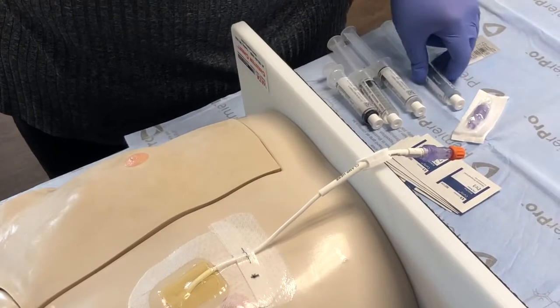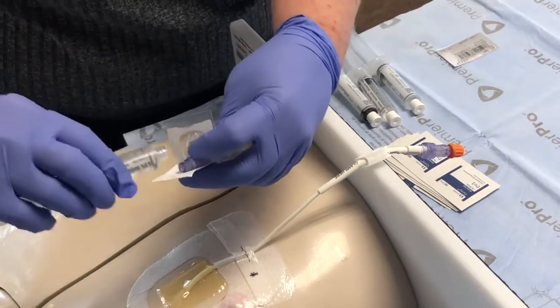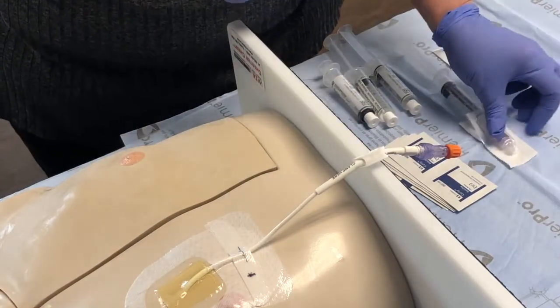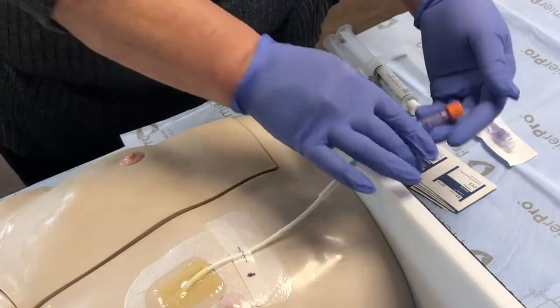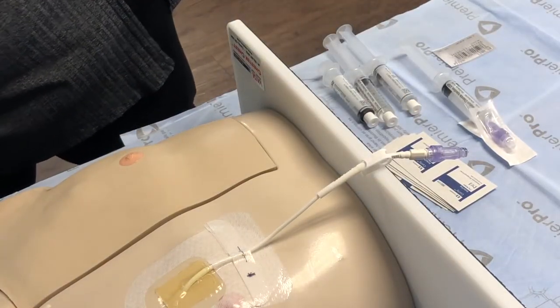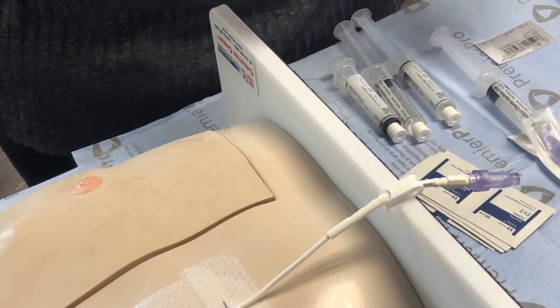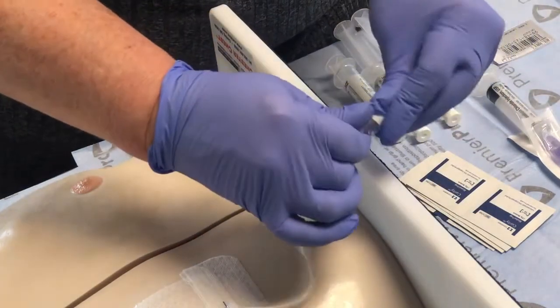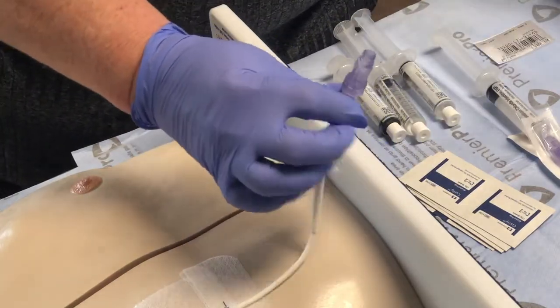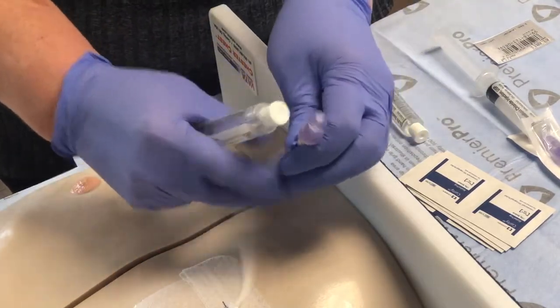Prime a new hub with a saline flush, leaving the syringe attached and the hub in its packaging for cleanliness. If there is a swab cap attached to the hub, remove it at this time. Scrub the hub for a minimum of 15 seconds and allow to dry for 60 seconds. Unclamp the line, attach a saline flush, and aspirate for blood draw.